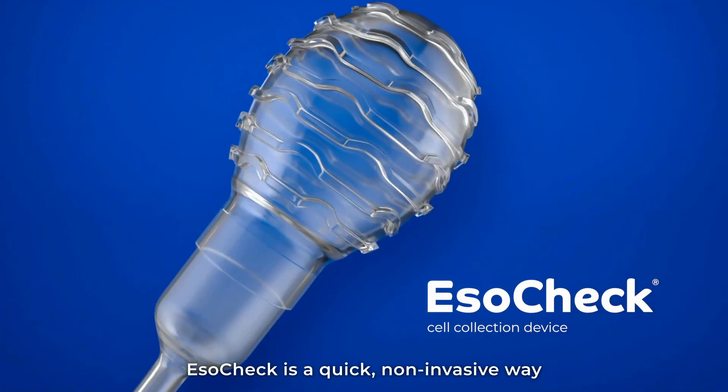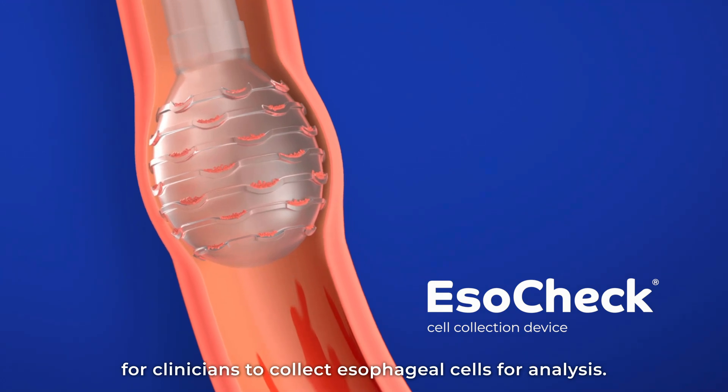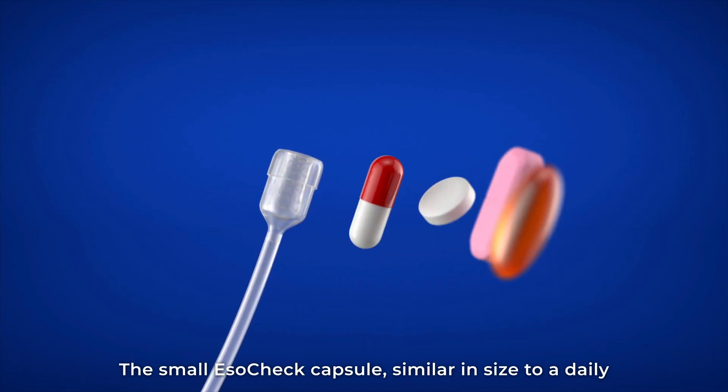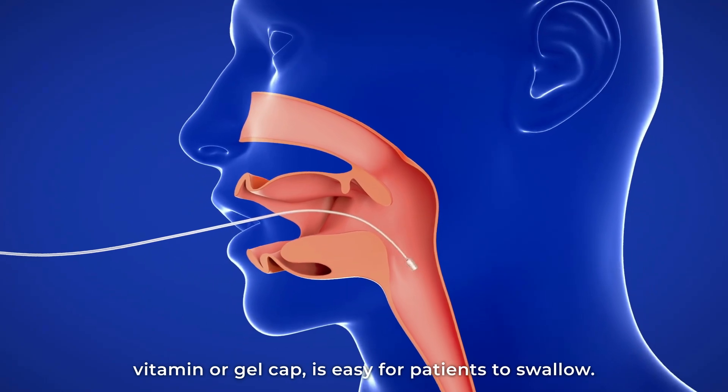ESOCHEC is a quick, non-invasive way for clinicians to collect esophageal cells for analysis. The small ESOCHEC capsule, similar in size to a daily vitamin or gel cap, is easy for patients to swallow.